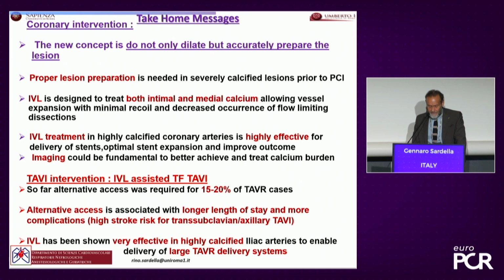So far, alternative access was required for 15 to 20% of TAVR cases, and alternative access is surely associated with longer length of stay and more complications, and higher stroke risk, in particular for transsubclavian and axillary TAVI. IVL has been shown to be very effective in highly calcified iliac arteries to enable delivery of large TAVR delivery systems and change our way of doing TAVI.